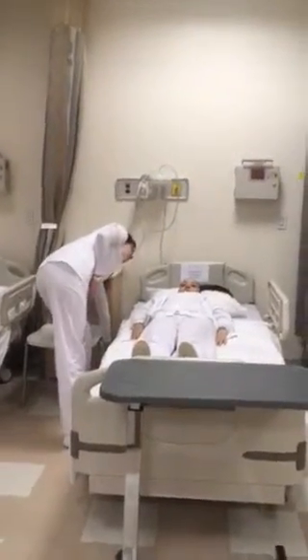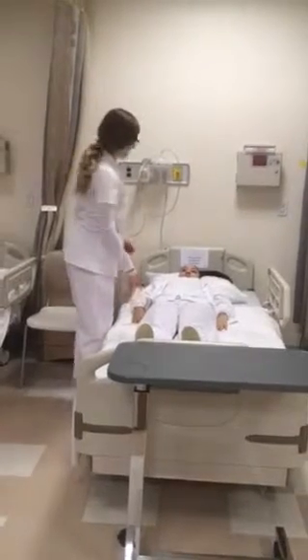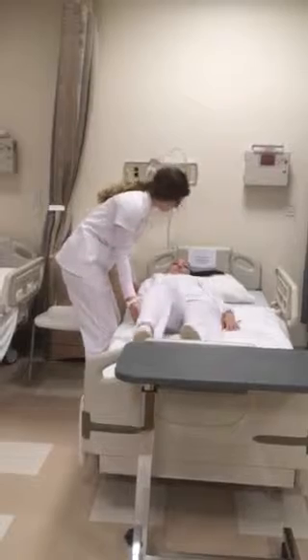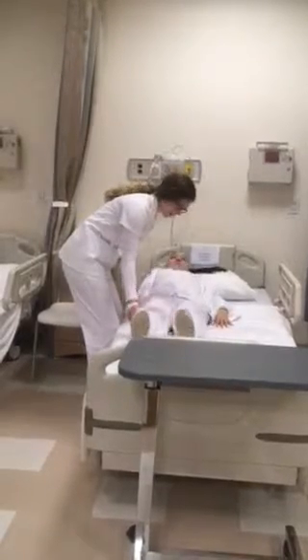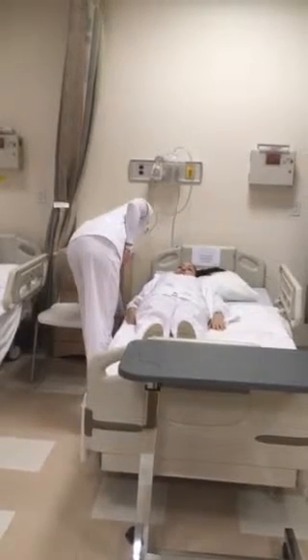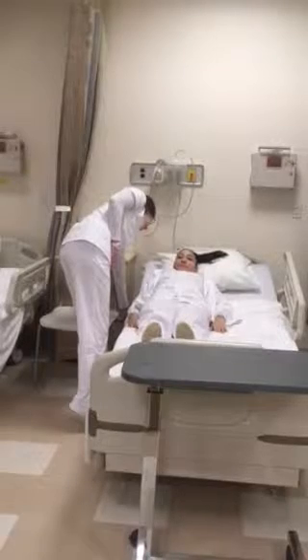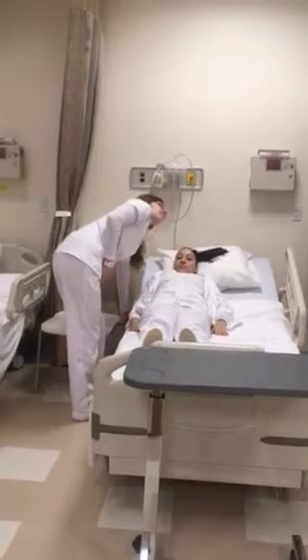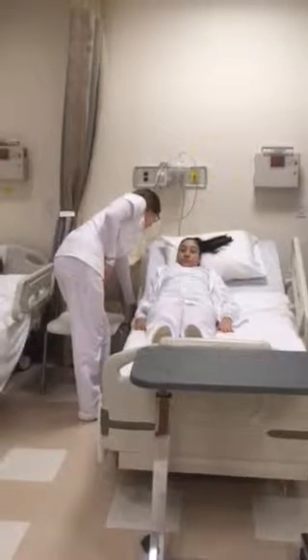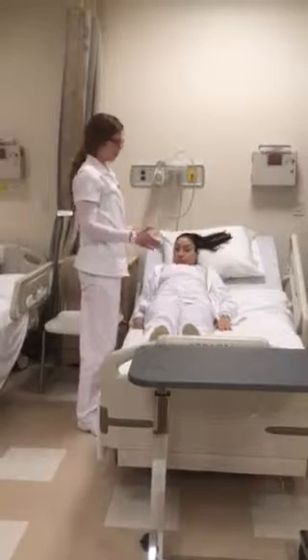Okay, so the next thing that I'm going to do is we're just going to make sure they're lowered all the way to the ground, and obviously they are already. So we're going to ask them to scoot to the edge and make sure you're there to prevent any falls. Alright, can you scooch over a little bit? Okay, that's perfect. Thank you. And now I'm just going to raise the bed about 30 degrees.